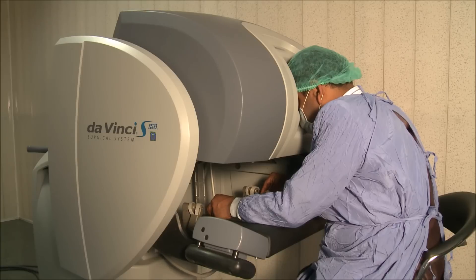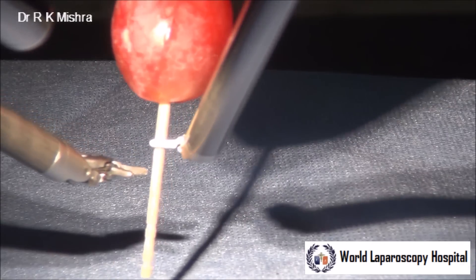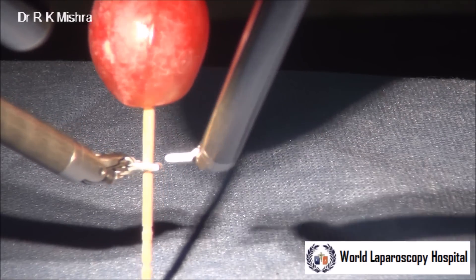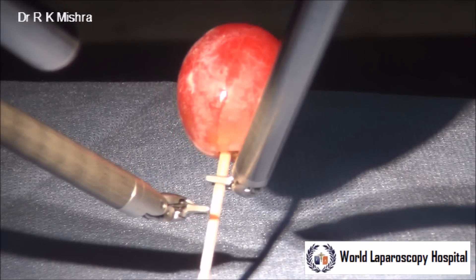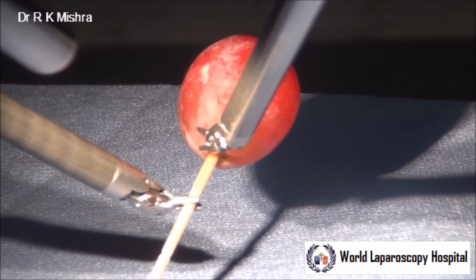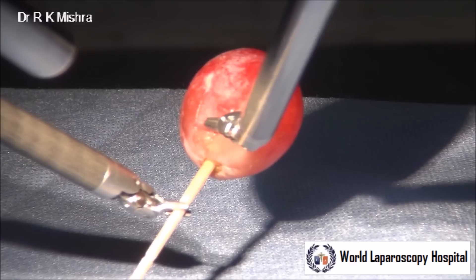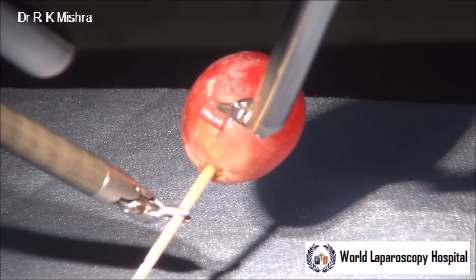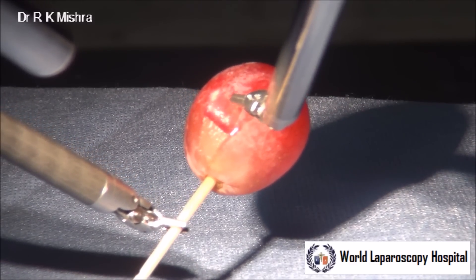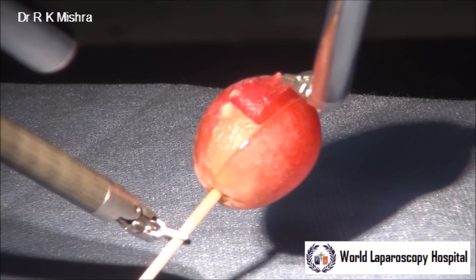Once you have cut it, you can take two micro needle holders — one will stabilize the grape and with the other one you can peel the entire skin off nicely. When you do that, you should try to maintain a smooth continuous traction. As we know there is no tremor in Da Vinci robotic surgery, this entire grape skin can be peeled off very nicely.